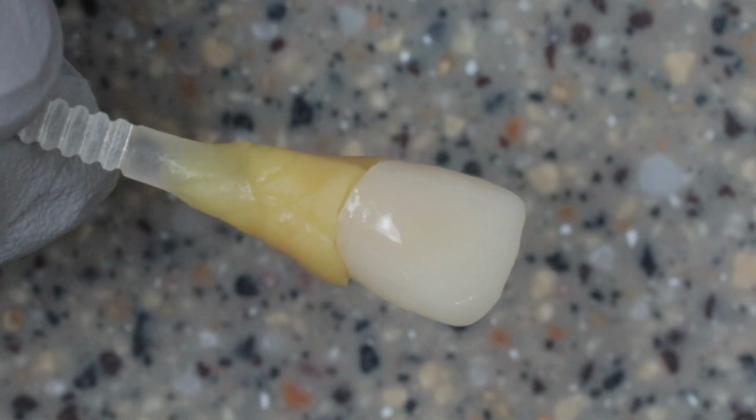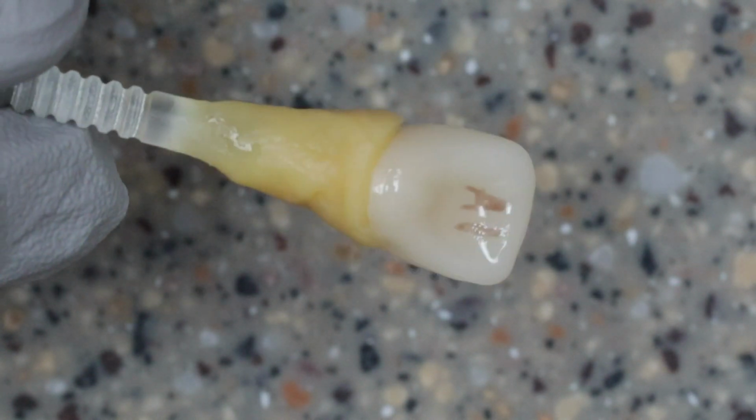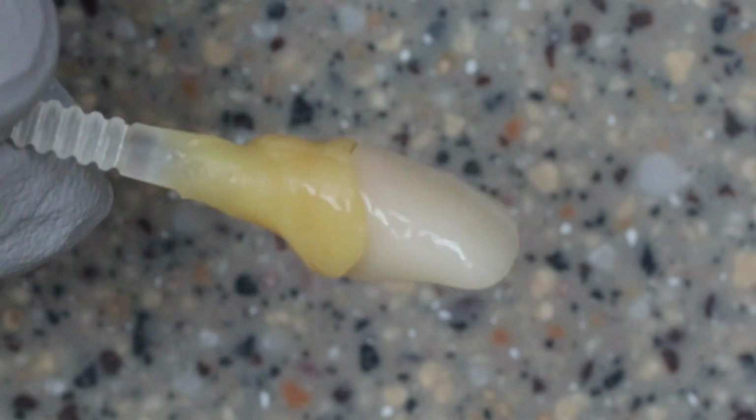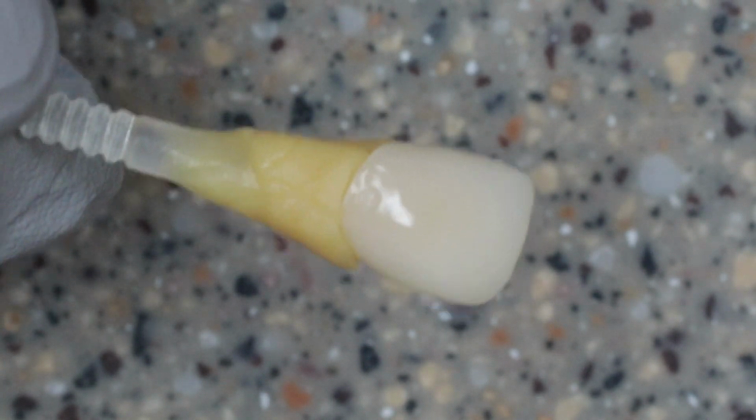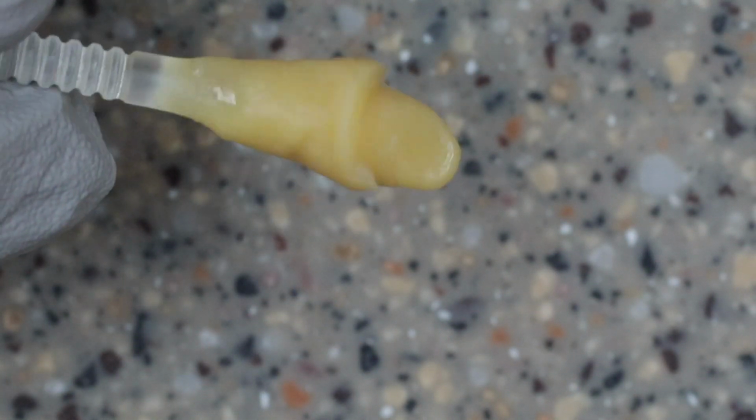I'll basically use it like I would a normal shade guide. I'll just stick it right up against the natural teeth and see how it looks. And maybe I determine, hey, this A1's a little bright. So then I can take this off, I can pop on an A2 and then repeat the process and see which one looks the best.